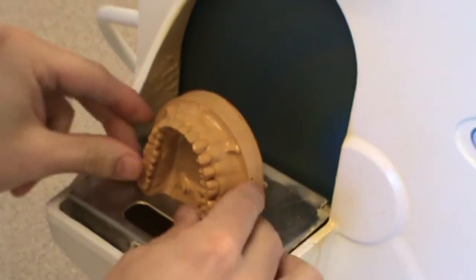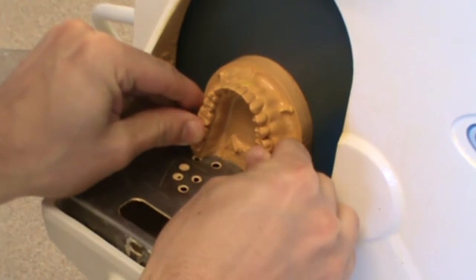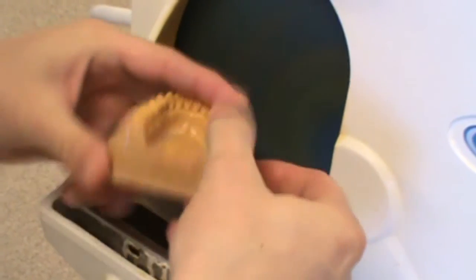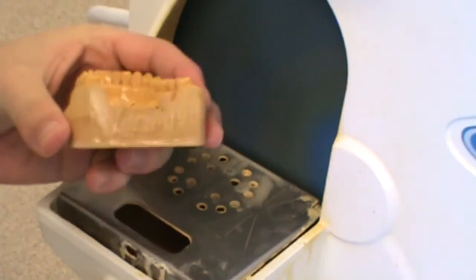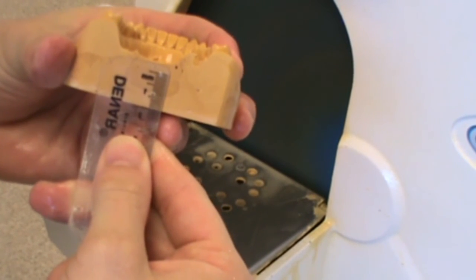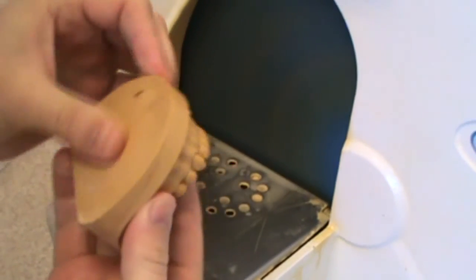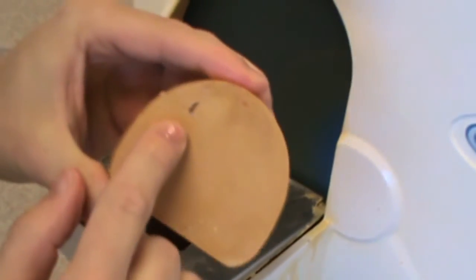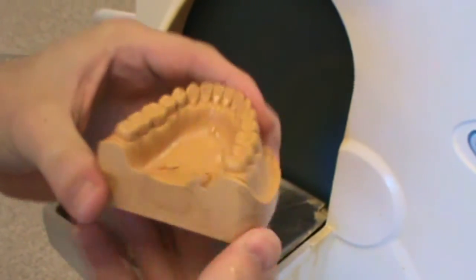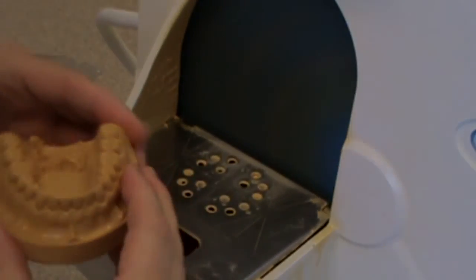I'm pulling the measurement down because I know I've got extra stone in that lingual area that I'm going to trim off in another step — about 15mm there, minusing that extra stone. You can see these little air bubbles here, and that's because I did not vacuum mix my base. So we're going to go and fill in those air bubbles with a little bit of stone. I'll show you in the next step how that's done.